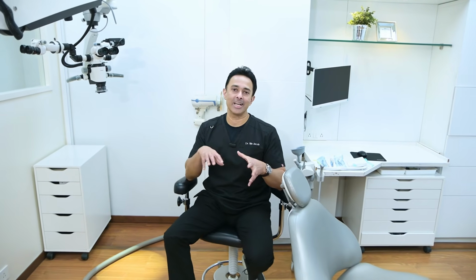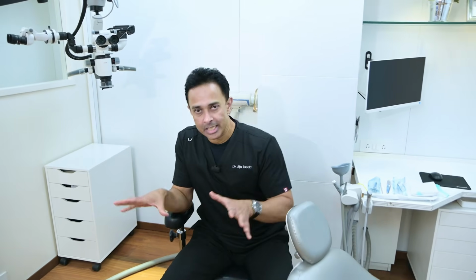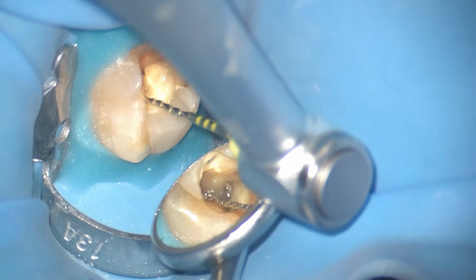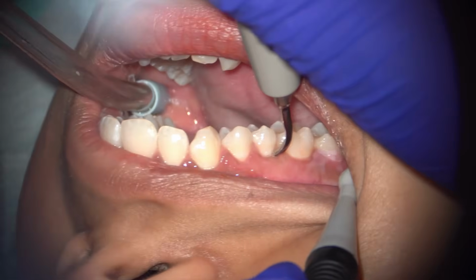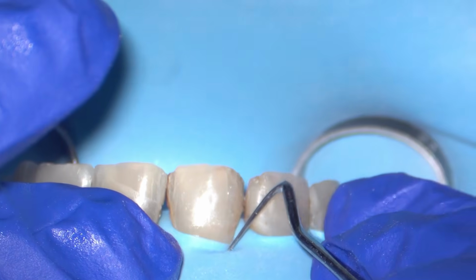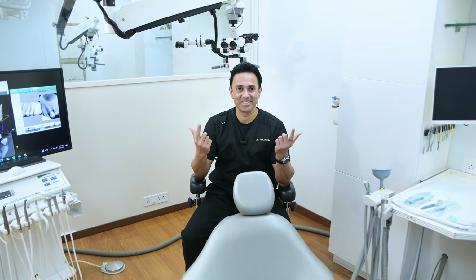By the way, this started as an endodontic practice, but as time went by, we moved over from endodontics practice or referral practice to a completely general practice. So today we do everything in general dentistry, not just endodontics. We do restorations, we do crown preps, we do surgeries, we do extractions, we do implants, we do everything in general dentistry in this operatory. There is no procedure that you cannot do with this kind of setup.